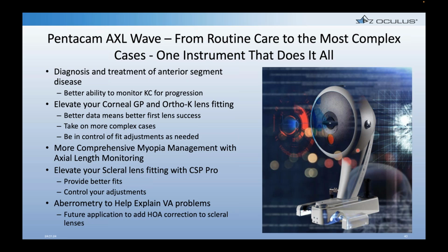Again, more comprehensive myopia management, because not only can we scan our patients and create their lenses, but we can monitor their axial length even as we're mapping their corneas at the same session, so that we can continually update all of that data.